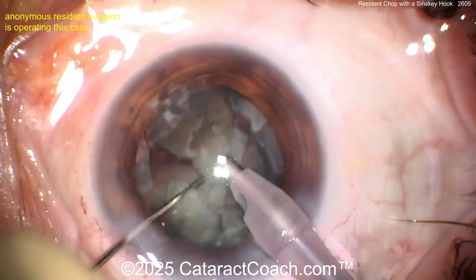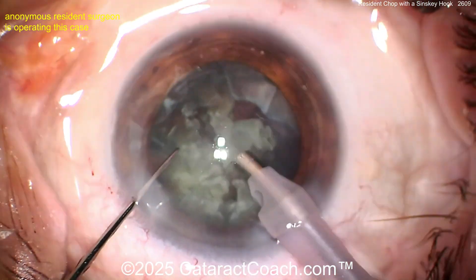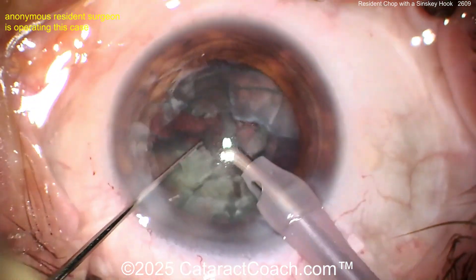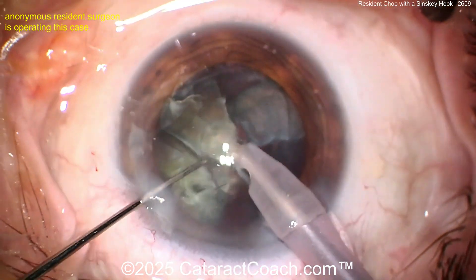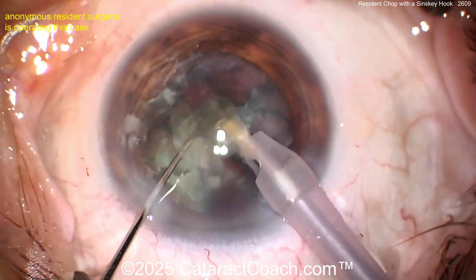Now let's finish up the case — buzzing into those nuclear pieces. You have to make sure they're fully separated. One of the challenges is if you don't fully separate the pieces, they're going to be stuck together at the bottom. Aspirate slowly, separate the pieces, and look — the other piece comes right up. The Sinski hook is a great option; it's simple and already on your tray.